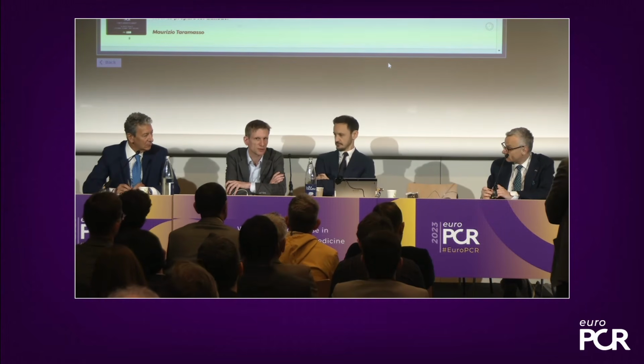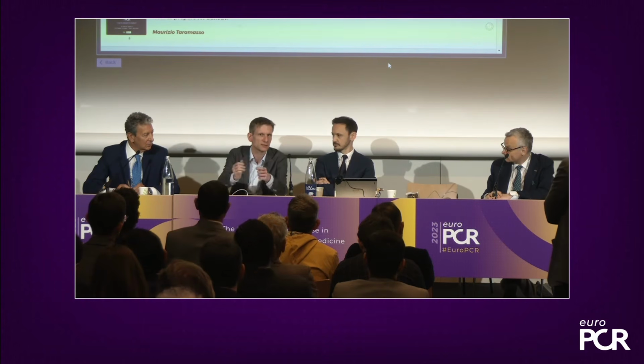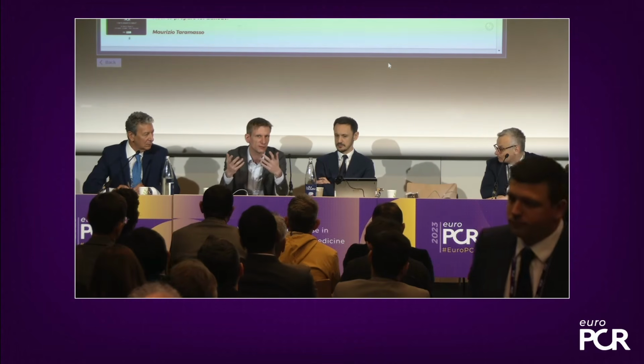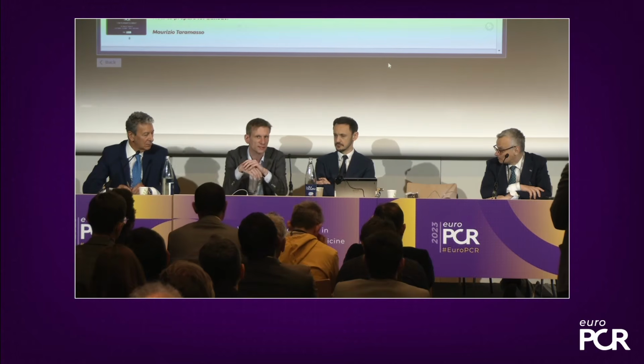Yeah, I've actually changed my strategy in the last 2 years to something super handy, and I don't like these controls from radial that use a lot of fluoro. It's very often not easy. If I see people doing this, what then if you see a bleeding? Then you're very limited in what you can do. Even then you're standing there with your radial approach, and to get there a balloon or a stent is almost impossible.